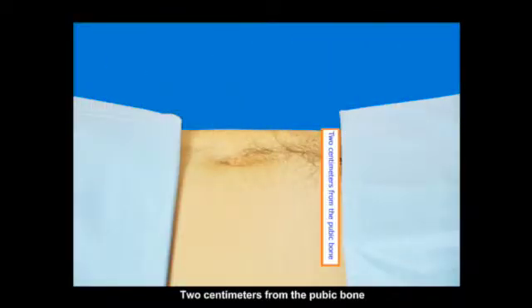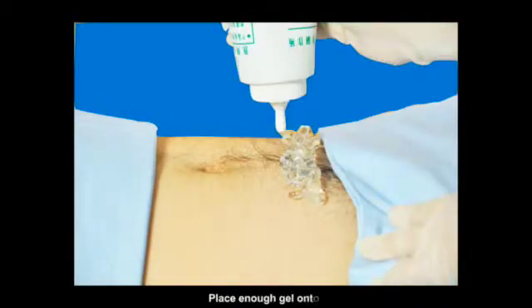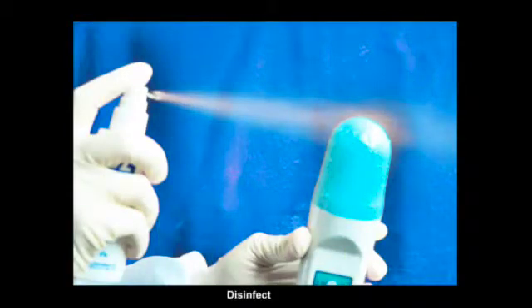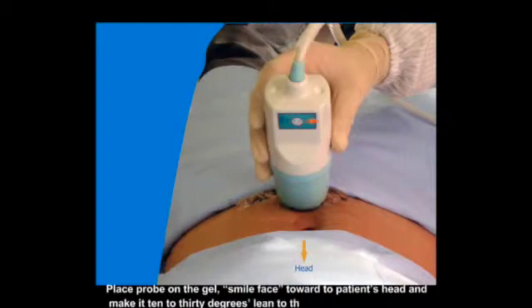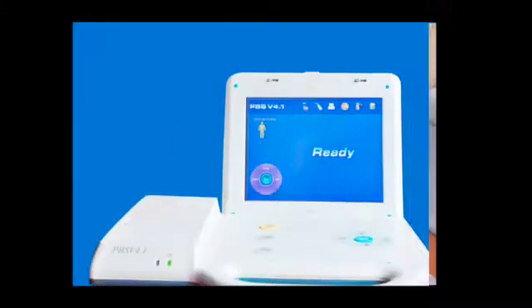2 centimeters from the pubic bone. Place enough gel onto the area. Disinfect the probe. Place the probe on the gel with the smiley face toward the patient's head and then tilt it 10 to 30 degrees forward towards the head.